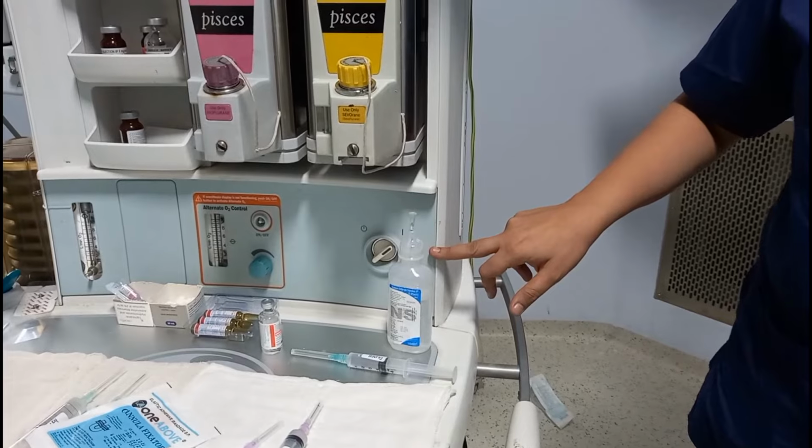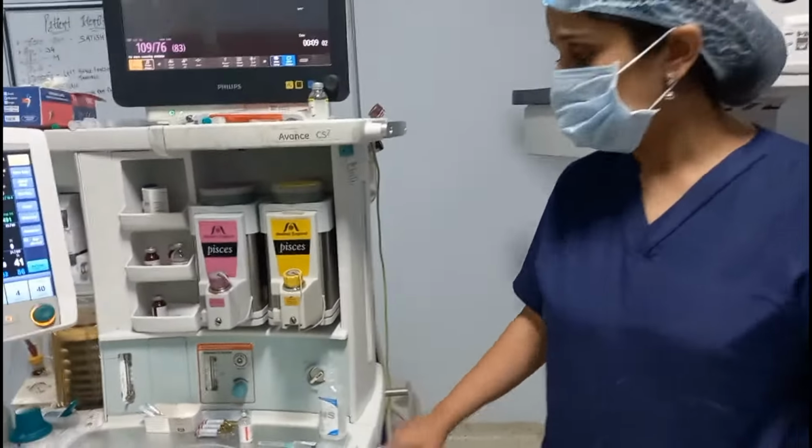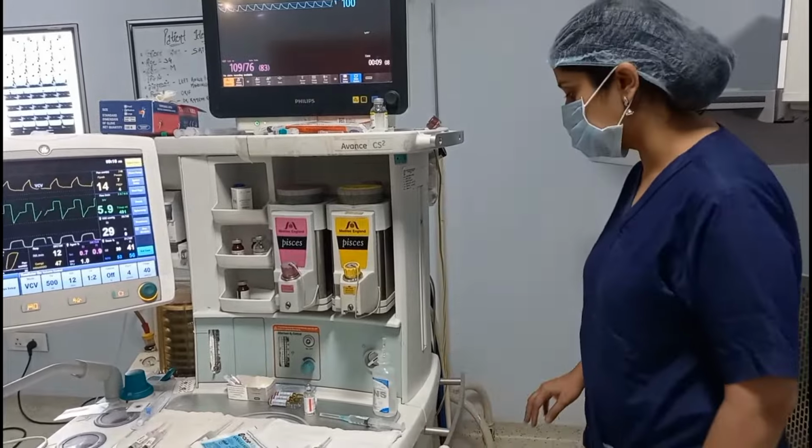This electrical switch has a UPS attached, like the UPS we have on our computer processing unit, so that if by chance the mains supply goes off, there is a reserve power with the machine and the machine can remain working.